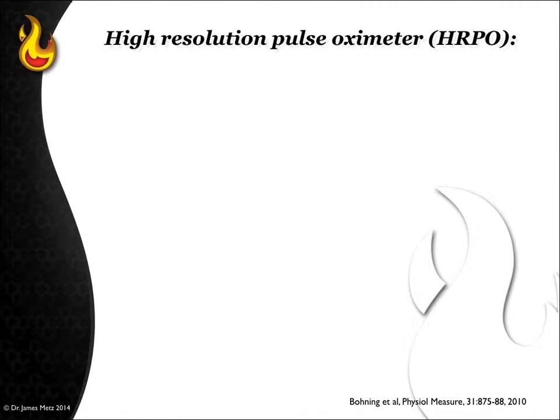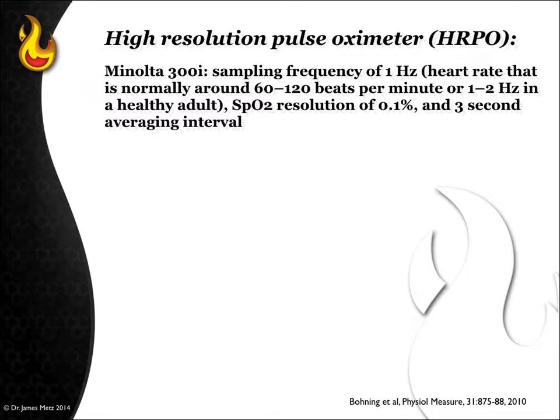High-resolution pulse oximetry, HRPO. It's a very overused term. The only one that I feel in the market today that's really what I consider to be high-resolution pulse oximetry is the Minolta 300i. It has a sampling frequency of 1 hertz, which means 1 time per second the heart rate is monitored.